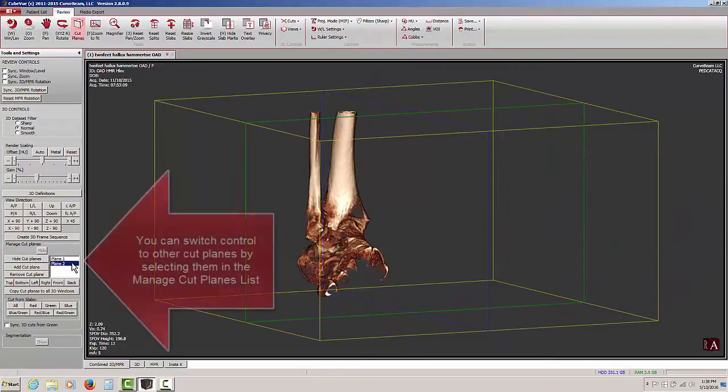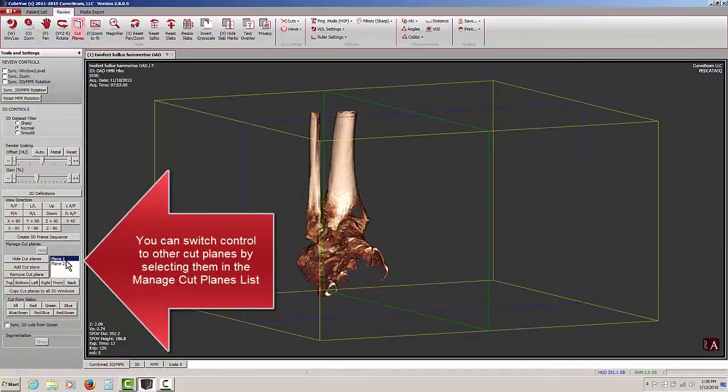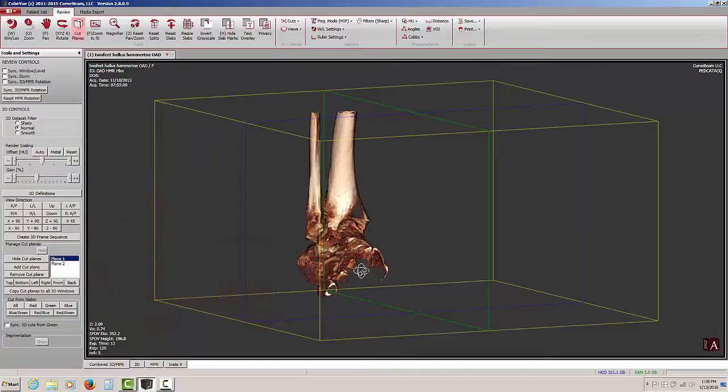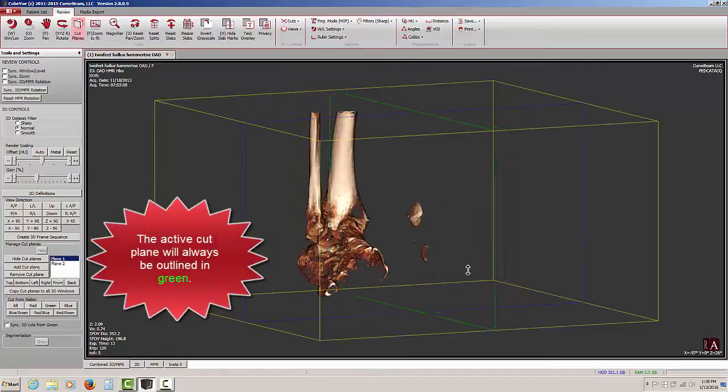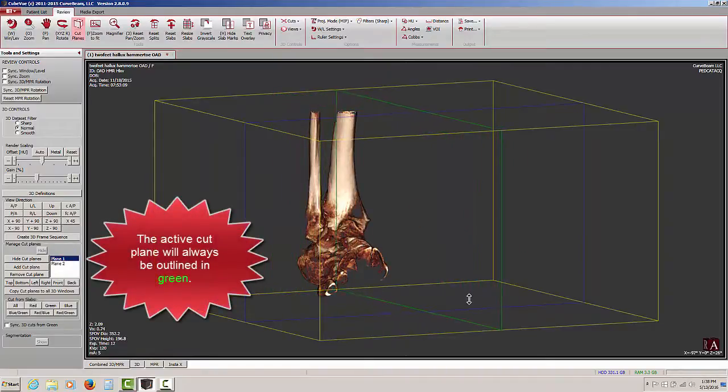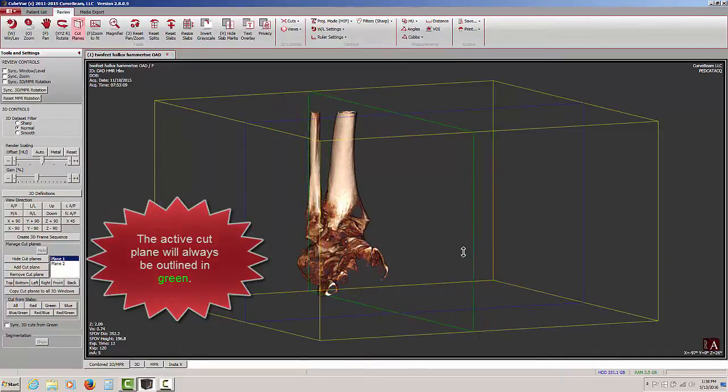I can also switch to the other cut plane by going over to the cut plane management window. And now I am shifting my cut plane from left to right. I have shifted to or moved control to the other cut plane.